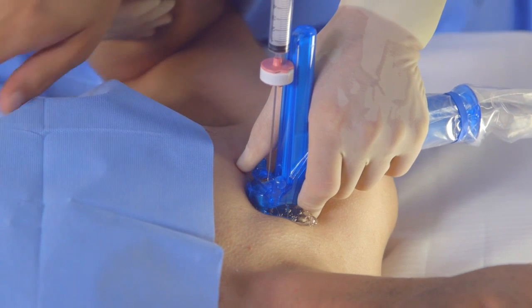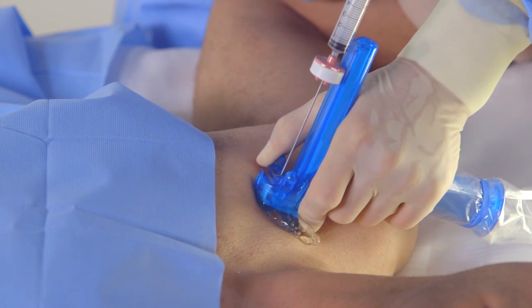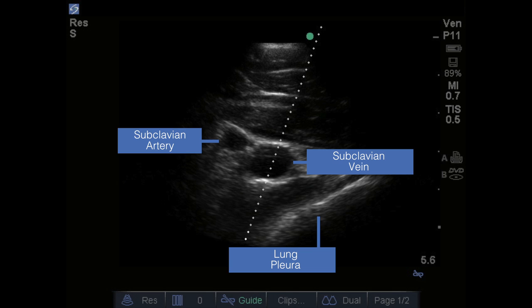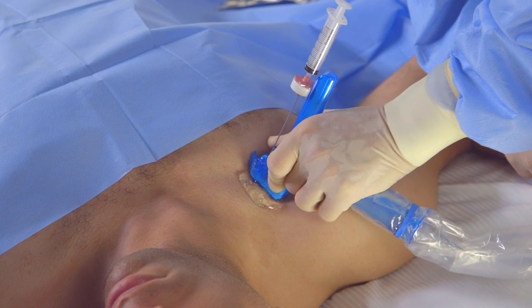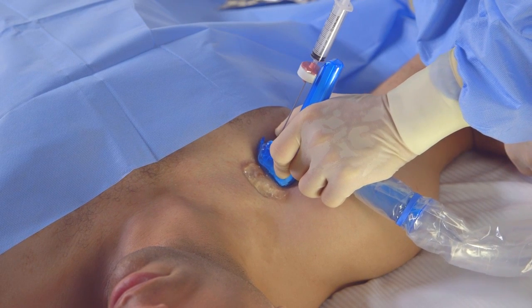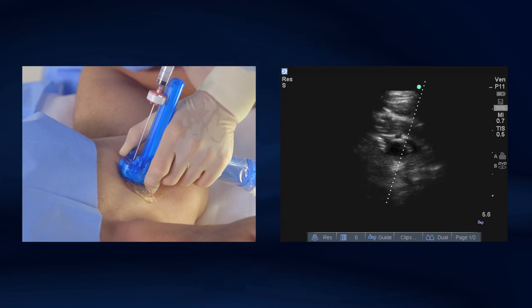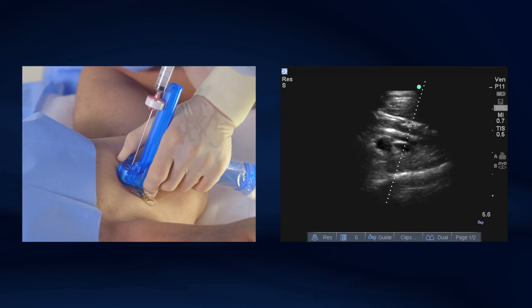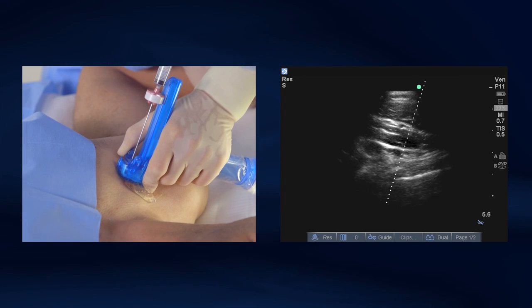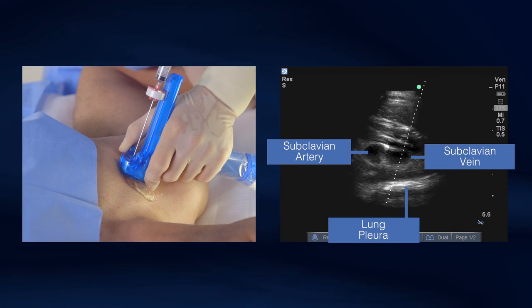Adjust the patient's arm until the best view of the subclavian vein is obtained. Observe that deep to the subclavian artery and vein, the pleura appears as a bright linear streak. Align the on-screen target line with the subclavian vein and prepare to advance the needle. Note that until the needle tip penetrates the skin, you may need to increase pressure with the probe to prevent image loss. However, once the skin is penetrated, you can let off pressure and proceed to advance the needle while observing the virtual needle as it approaches the vein.